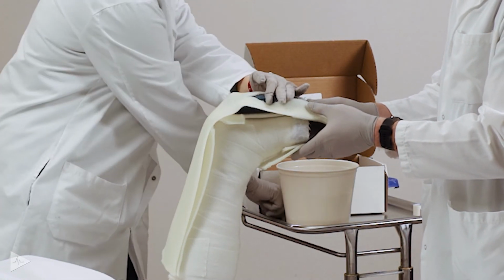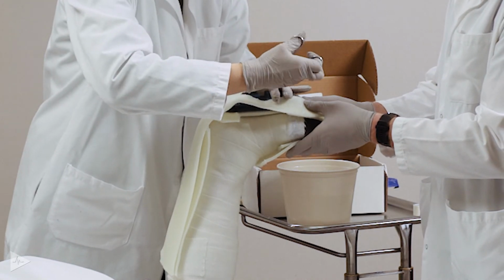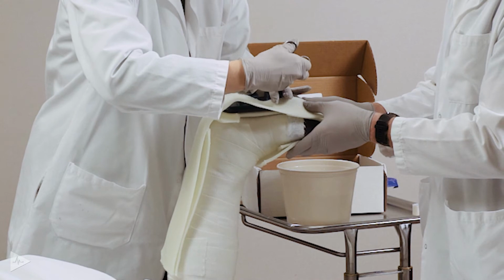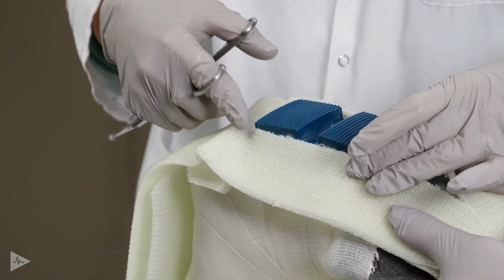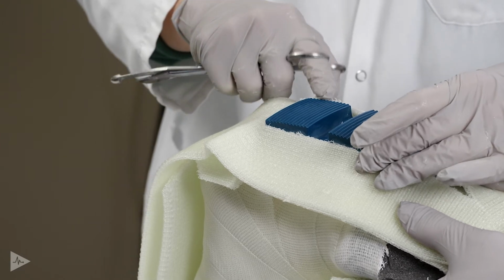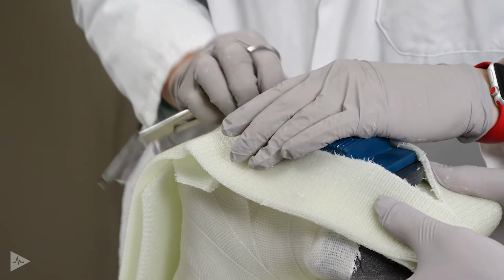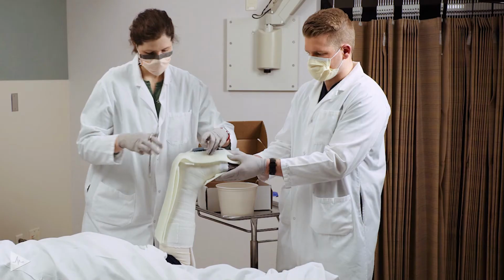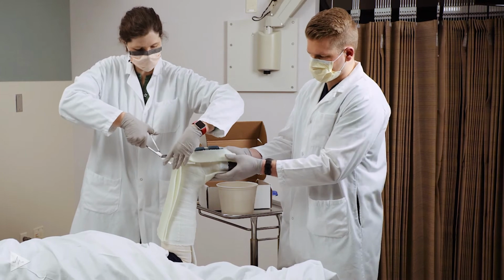And if you need additional trimming in this area to make sure that peg is fully exposed. So you want to make sure that completely comes down on the side so we don't have any little fiberglass pieces sticking up, because those will be slippery if they come in contact with the ground. And again, we will want to trim the puckers on the side.